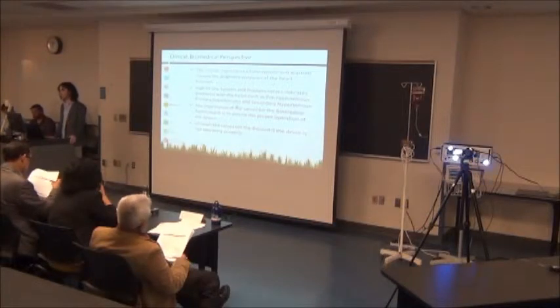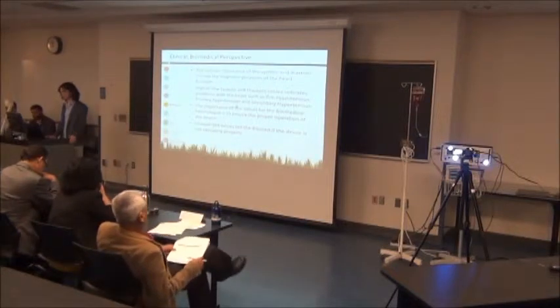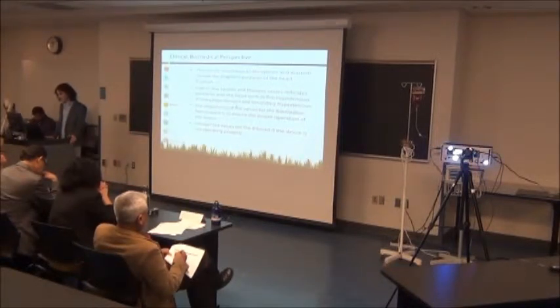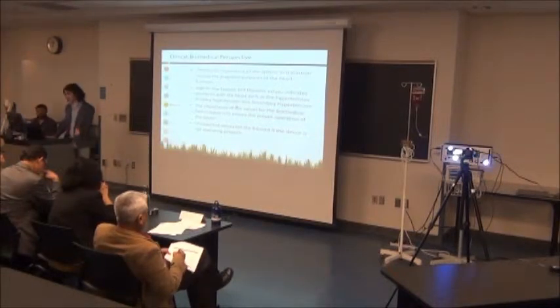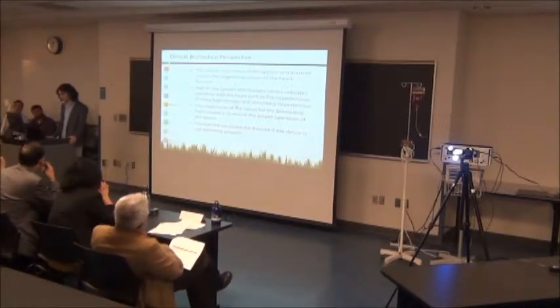They can look at the heart of the patient by three elements: the ECG waveform, the blood pressure signal, and the heart sounds. So basically they can diagnose the situation of the heart. They can detect if there is any pre-hypertension, primary hypertension, secondary hypertension.